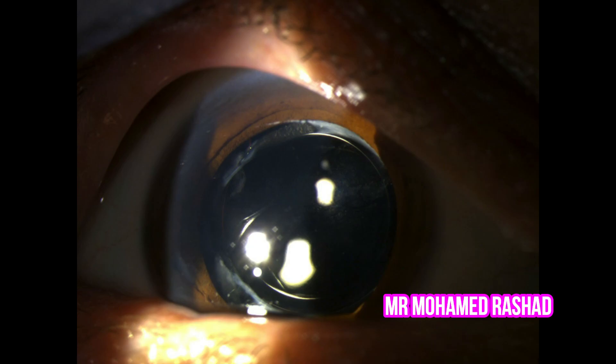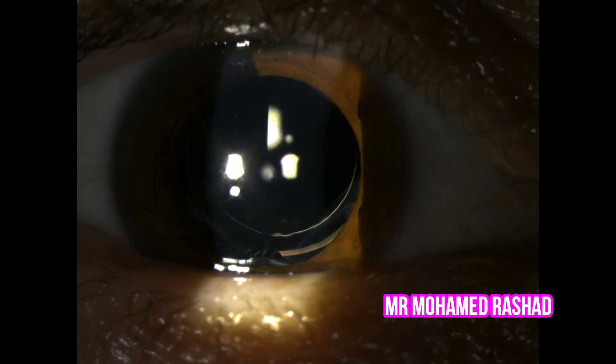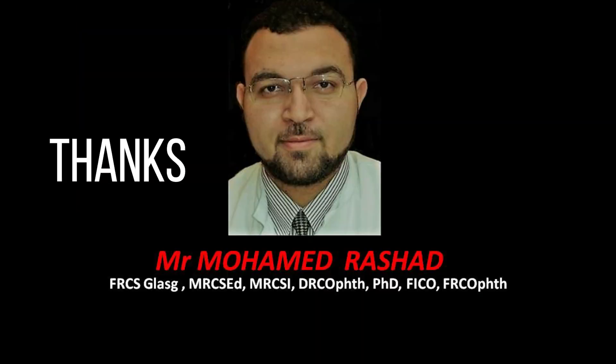The visual axis is now clear. This is shown by retro-illumination. Make sure that you don't go outside the edge of the optic of the intraocular lens. After one week, the patient's vision is 6/4. Thank you very much.